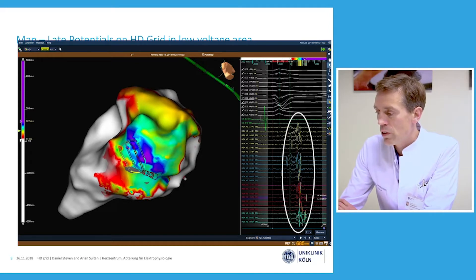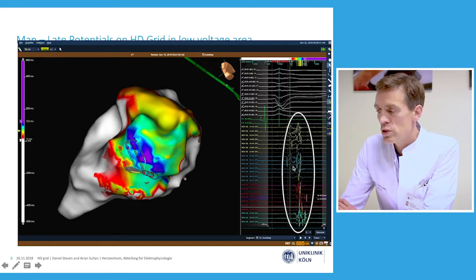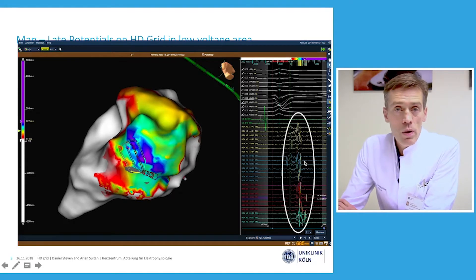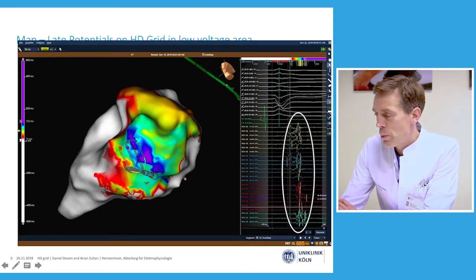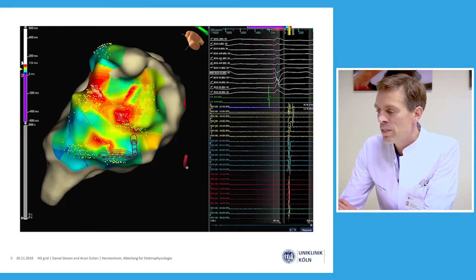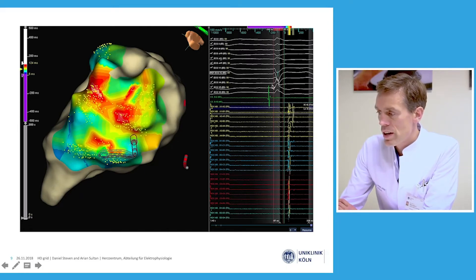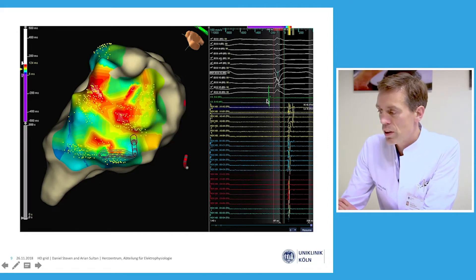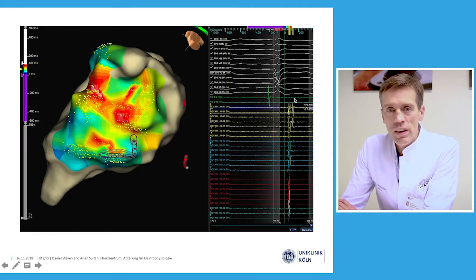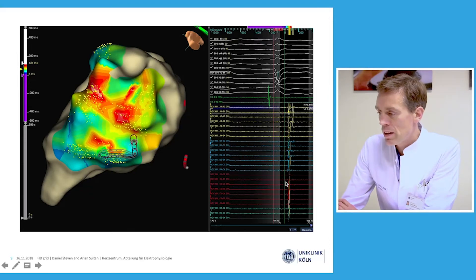We see slowing of the local electrogram with a signal width of almost 200 milliseconds, which is supposedly one of the mechanisms underlying this ventricular tachycardia. Other sites also depicted here with the Orion catheter show late potentials as well. As you can see, the QRS complex is already completed here while late ventricular activation is still ongoing in the HD mapping catheter.